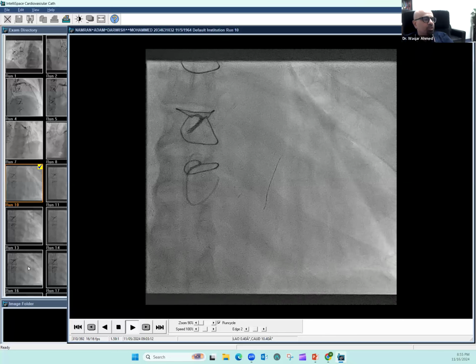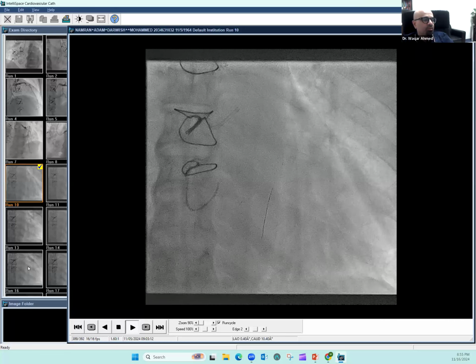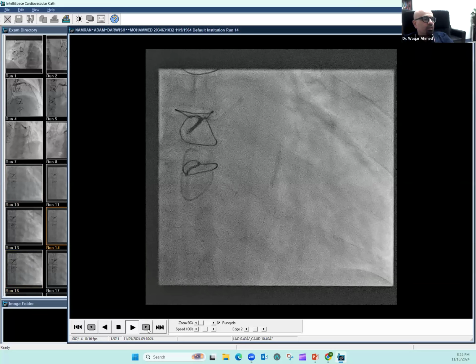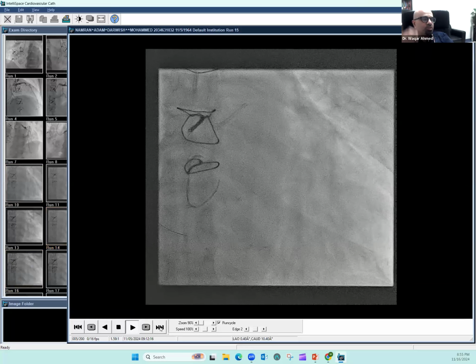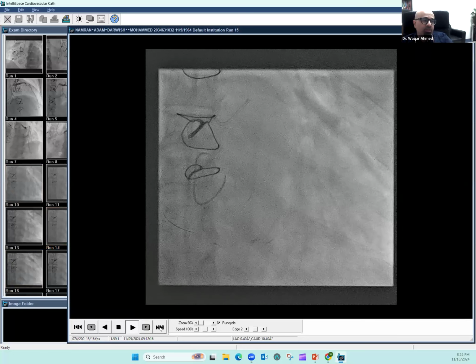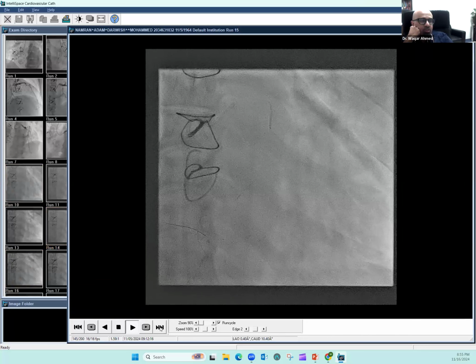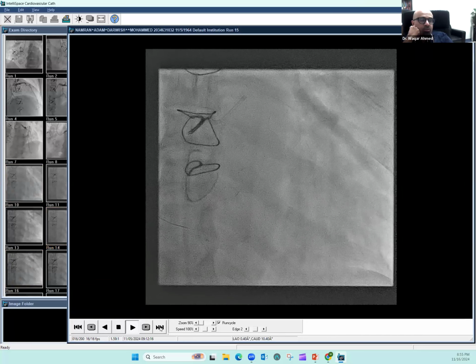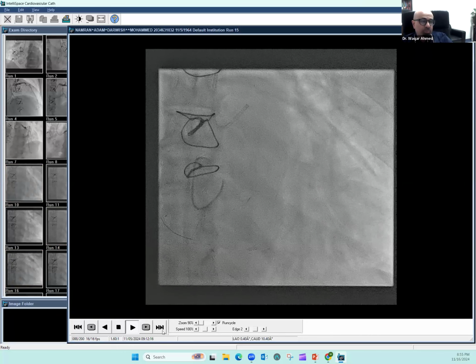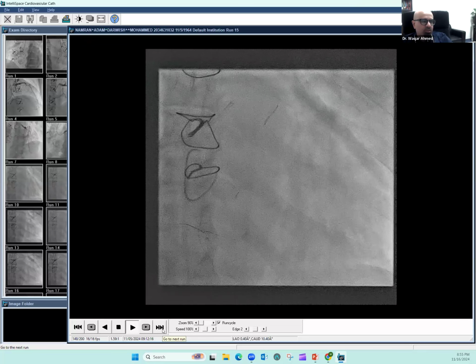And so here's the wire that went. I actually wanted the wire to go back into the distal PDA, which it did. And the next view, sorry, is after pre-dilatation. I wanted to show you the Nagomi stent, how flexible it is in going down this extremely tortuous vessel, turning, making all the turns, and it went down. I took down 2 stents. I took an 18 millimeter 2.75 and a 3.0 15 based on IVUS, mainly because I did not want to push a very long stent down.